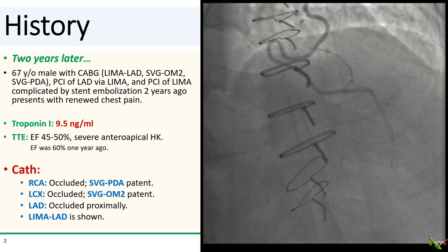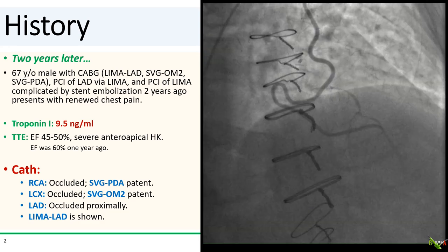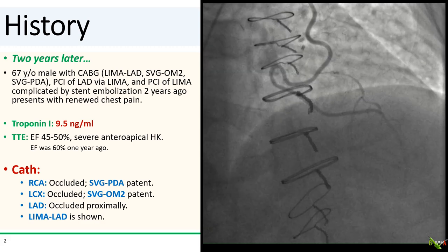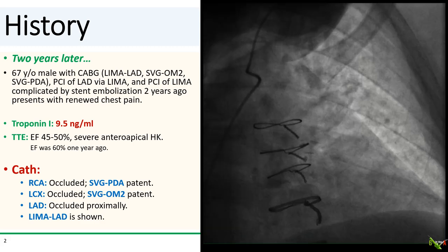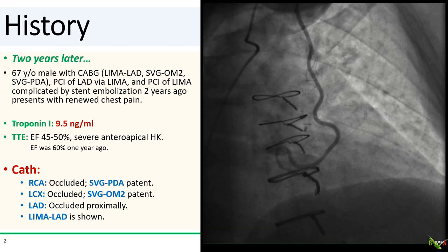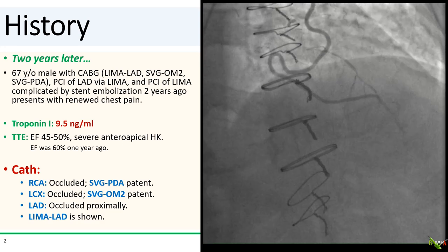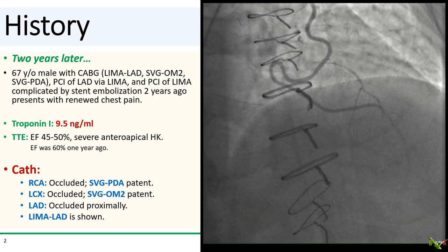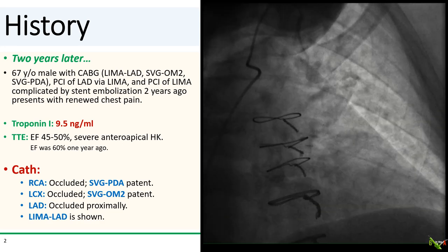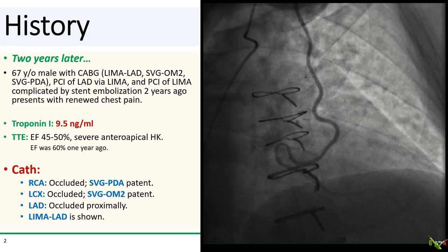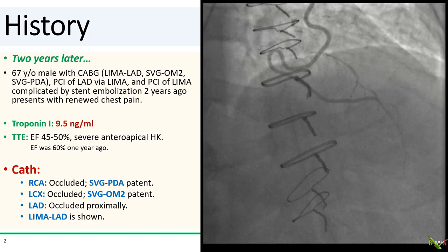His EF, which had improved to 60% one year ago, is now 45 to 50% with severe anteroapical hypokinesis. On cath, his native arteries are now all occluded. Both vein grafts are patent, and the LIMA to the LAD is shown here.